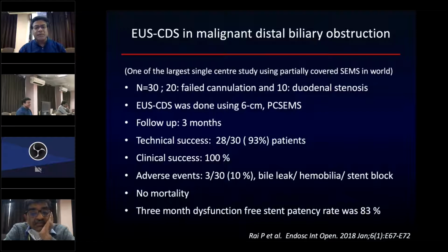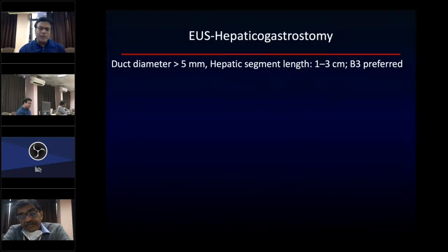Technical success was 93%, clinical success 100%, adverse events to the tune of around 10%, which were bile leak, hemobilia, and stent block. And all these complications could be managed conservatively. No mortality, 3-month dysfunction-free stent patency was 83%. So this is what we did in this particular case.